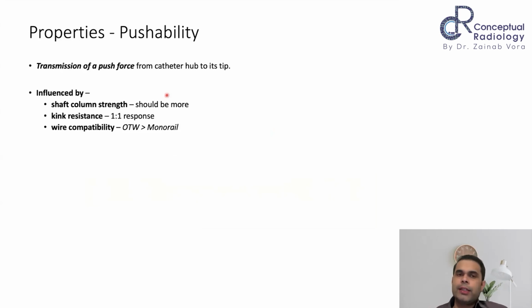Now the second part is, I've reached that place, I have a thin balloon, but what force am I applying? Is it going across through the entire shaft and being applied at the stenotic area? I'm putting some force. Instead of buckling, the entire force should get transmitted to the balloon tip. So how can that be designed?